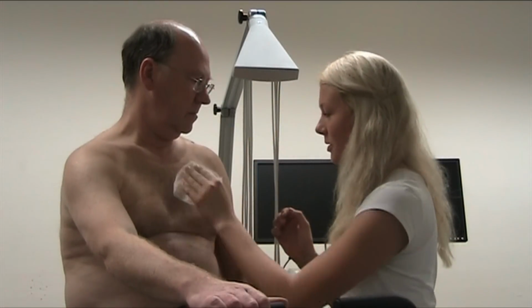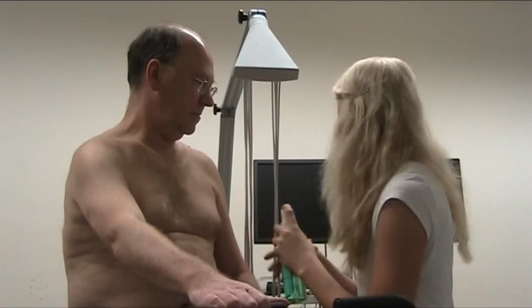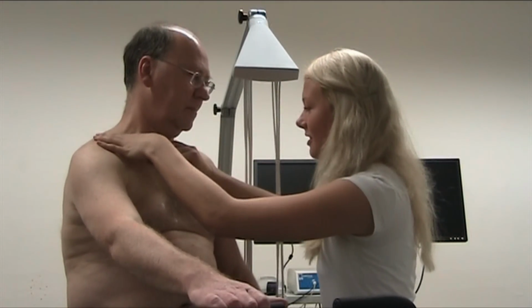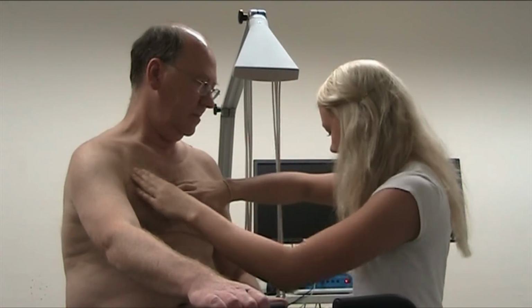The ECG records the electrical activity of the heart, which is displayed on the monitor. The ECG consists of 10 ECG leads that are placed on the patient's body. These 10 electrodes are applied sequentially to the front and back side of the body.